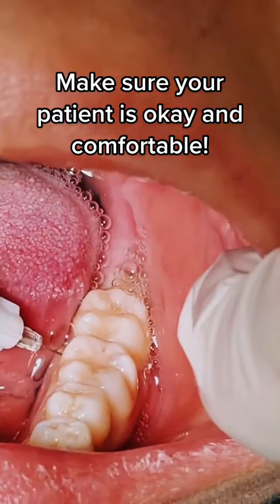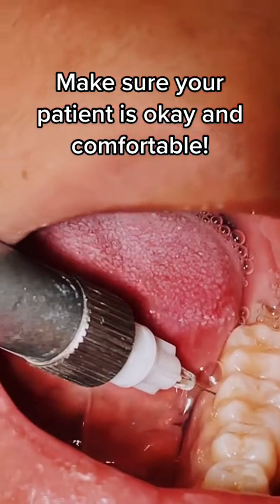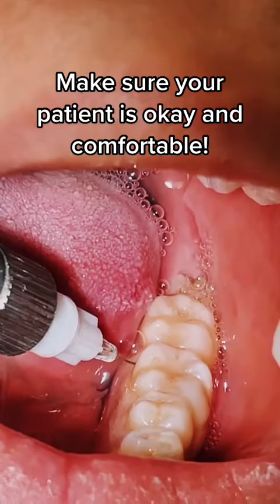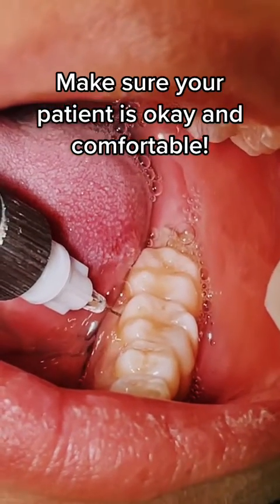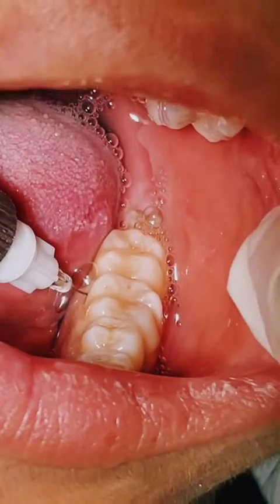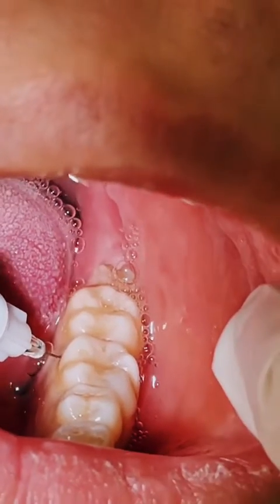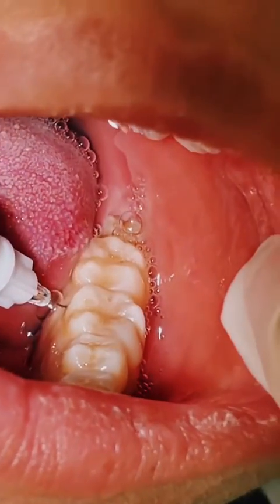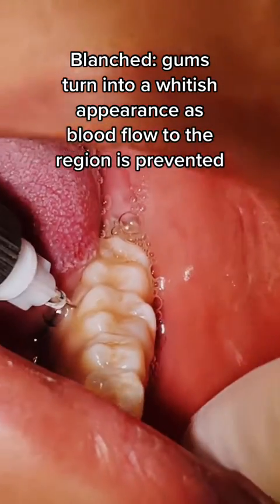She'll feel it, but I would have told her she'll feel this a little bit. If she trusts you to give this anesthetic without having too much in there, she knows that's all she'll feel. This is a lot better shot because it doesn't hurt — they just know that something goes into their PDL. The gums are starting to get blanched already. Turn to your left — see how it's blanching already?